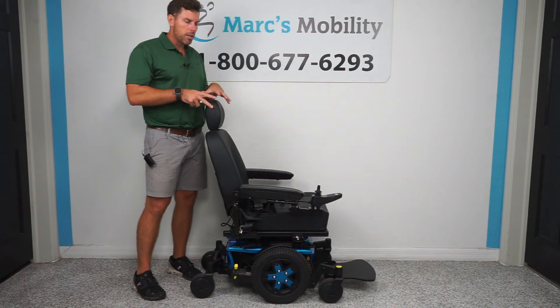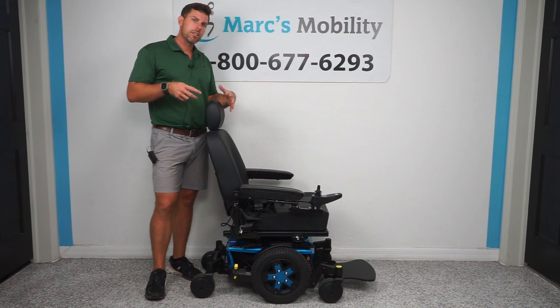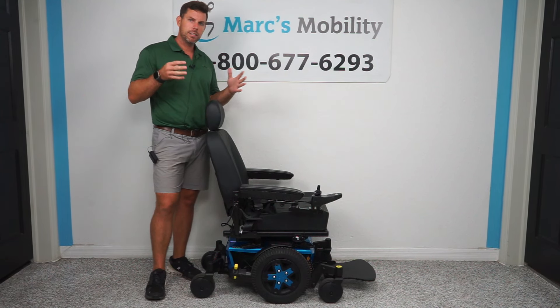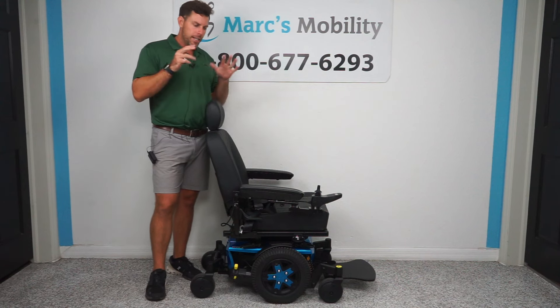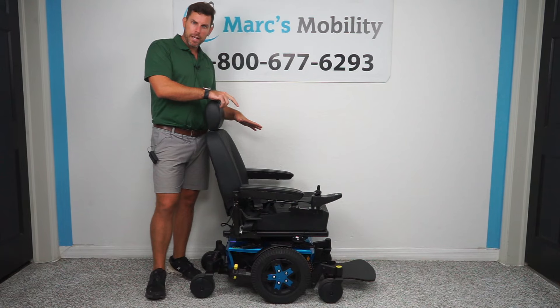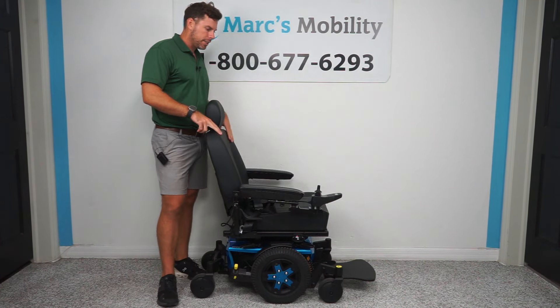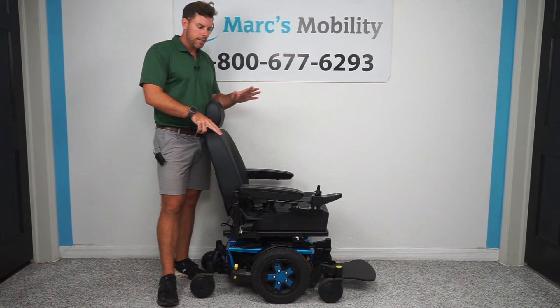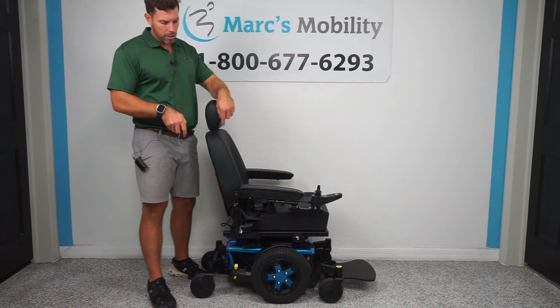This is a Quantum Edge 3. Quantums are able to have tons of different seat functions on them, so don't be confused when you see the name Quantum and you see seat lifts and all this. This particular unit is just a standard power chair with the Quantum base. Quantums are able to have different seating systems, but this is just a standard seat if somebody just needs to get from A to B but likes the quality and the design of the Quantum.